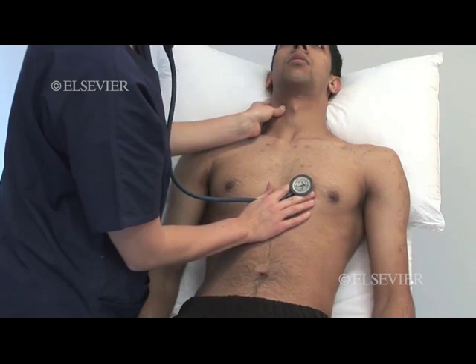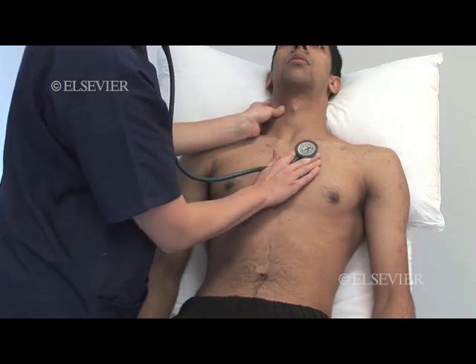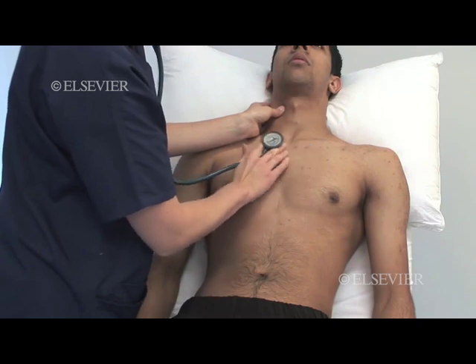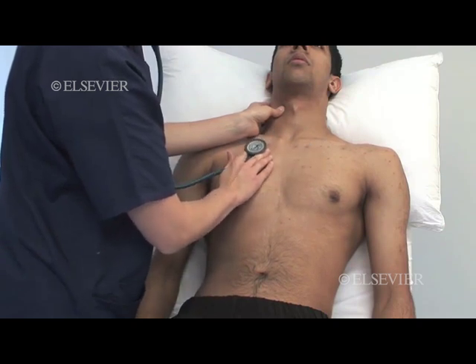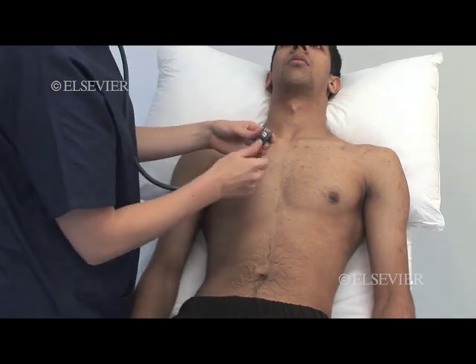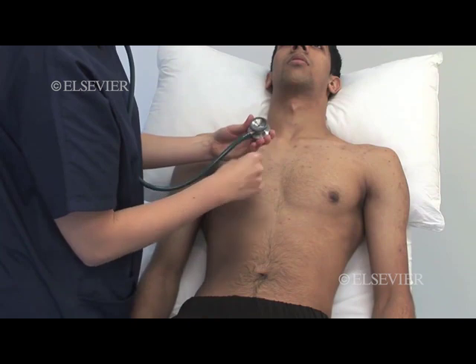Feel the carotid pulse with your thumb to time any murmur. Concentrate in turn on systole and diastole. Listen for added sounds and then for murmurs. Soft diastolic murmurs are sometimes no more than a so-called absence of silence.